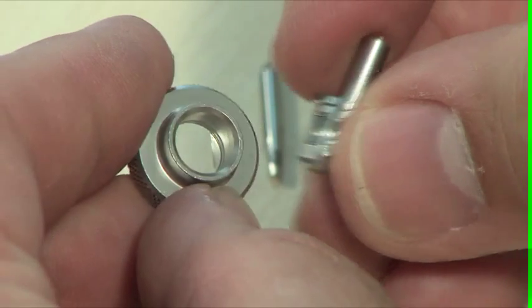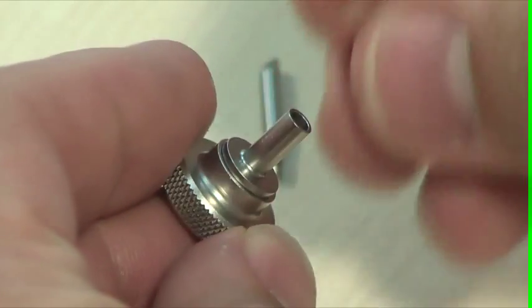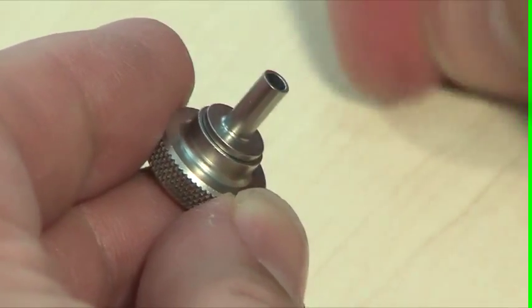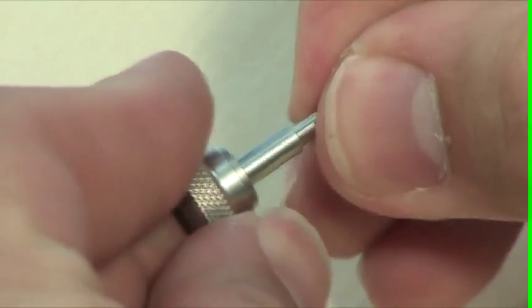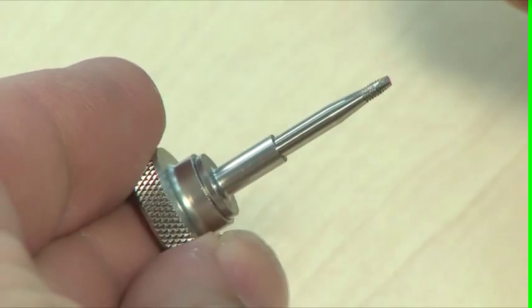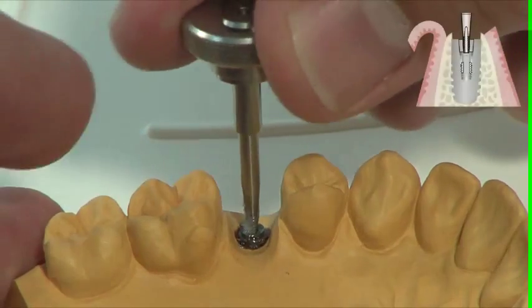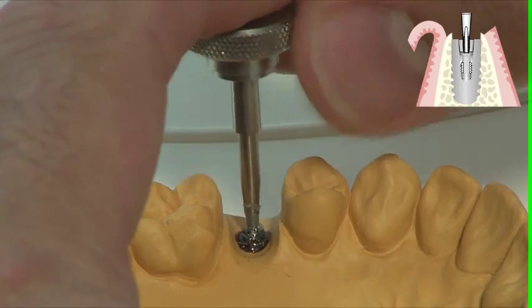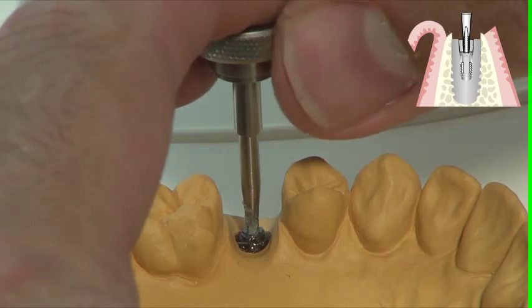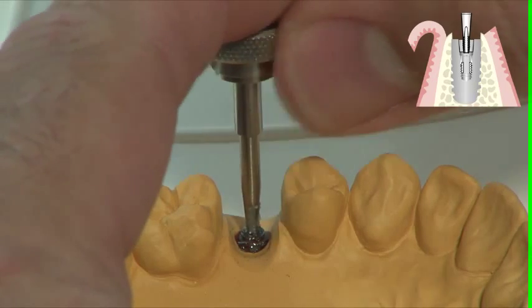Install the screw tap M1.6 in the medium ratchet insert for instruments, or in the short version if there is a lack of space. Use the handle for the ratchet insert or the surgical ratchet. Always use Vaseline for thread cutting. Proceed with care and do not overload the instrument. Do not forget to turn backwards at regular intervals in order to break up the chips. You need to perform two or three full rotations.